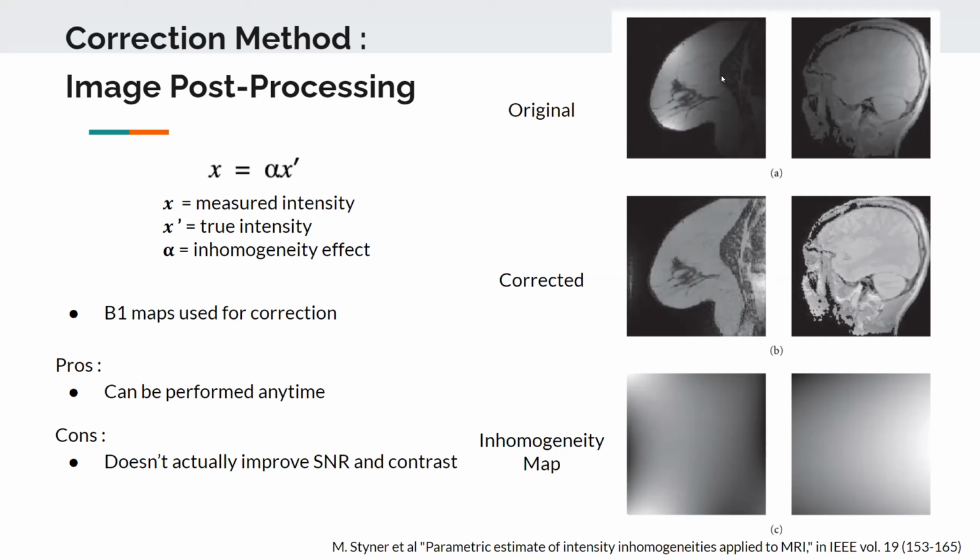I might have missed it, but did you mention anything about parallel transmit? Because I haven't seen. Yeah, so really parallel transmit is the way that people are solving B1 homogeneity right now. This is the way that has been used, and that's really the major way that people have been able to mitigate field inhomogeneity at 3T.